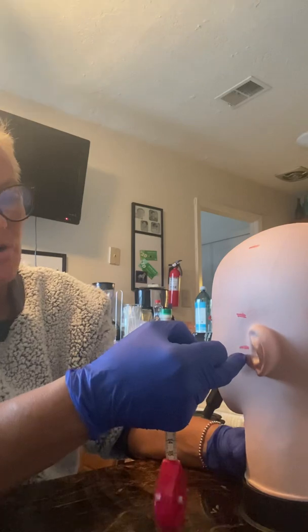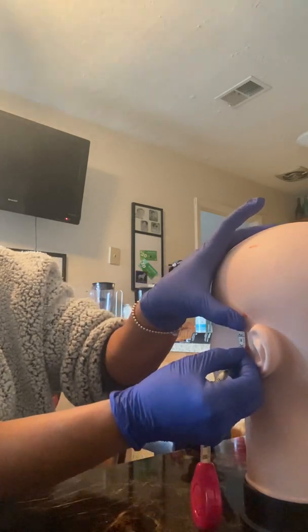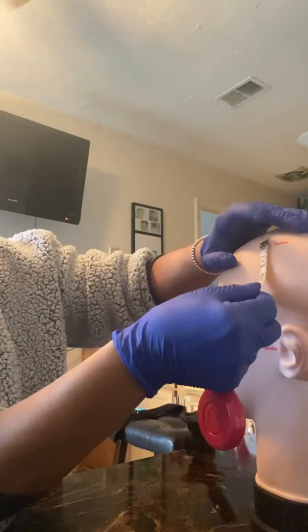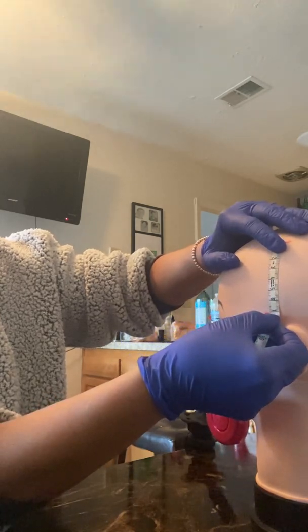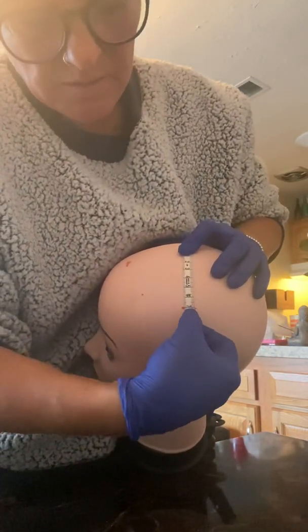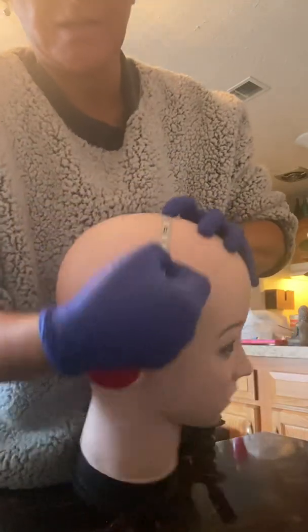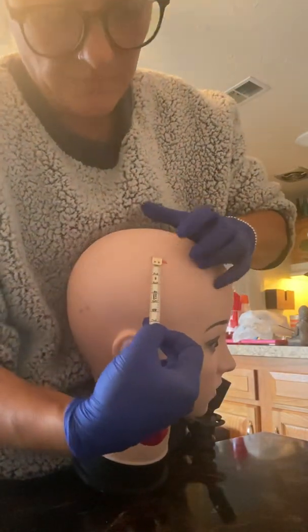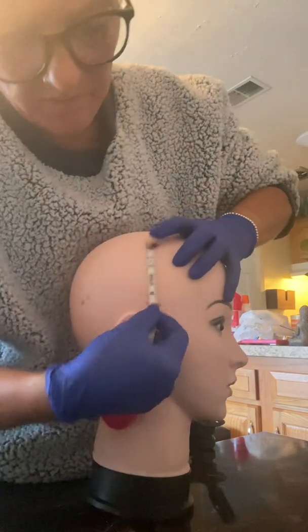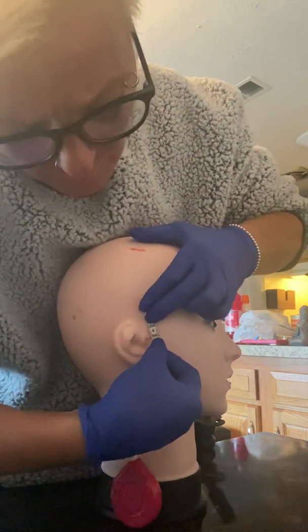Now we're going to check our preauricular points. From our preauricular to T3, we got 3.5. From T3 to C3, we have exactly 7. From CZ to C3, we have 7. From CZ to C4, we have 7. From C4 to T4, we have 7. And from T4 to our preauricular, we have about 3.3.